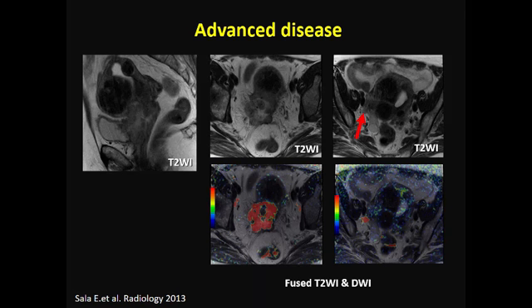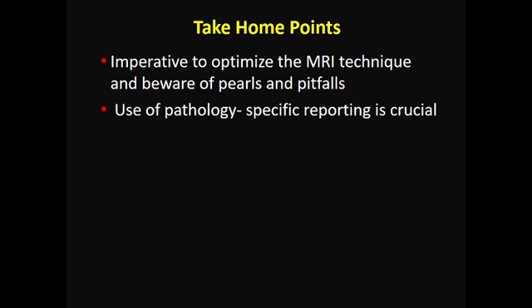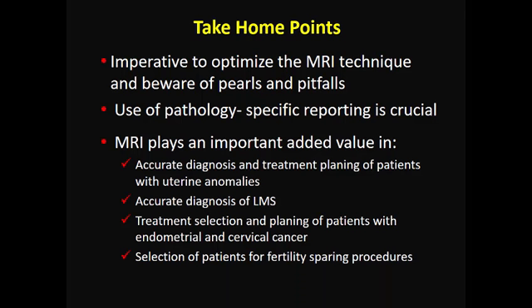So with 1 second left, this is my last slide. Take-home points: it's imperative to optimize the MR technique and beware of pitfalls. The use of a pathology-specific report is crucial, and it's crucial you talk the same language with your clinicians. And MRI does play an important role and adds value in all those indications that I discussed with you. And again, working with the clinicians is how we promote our modality and its added value.